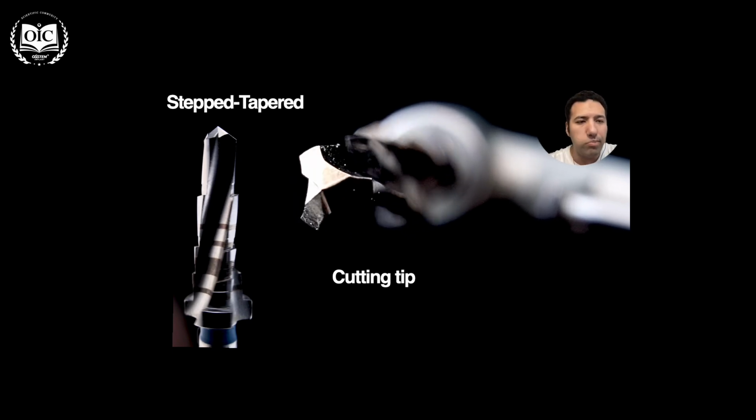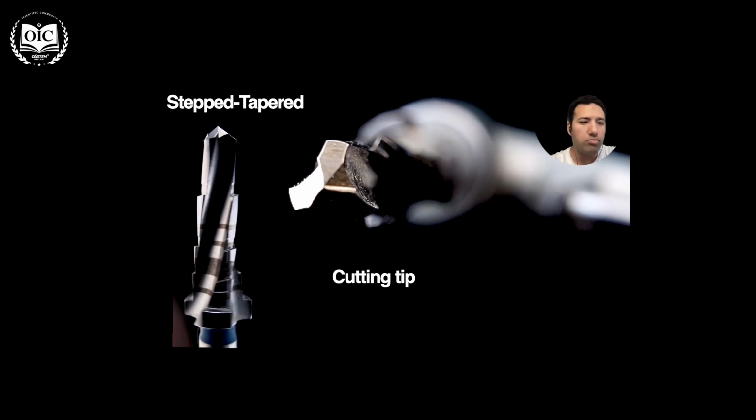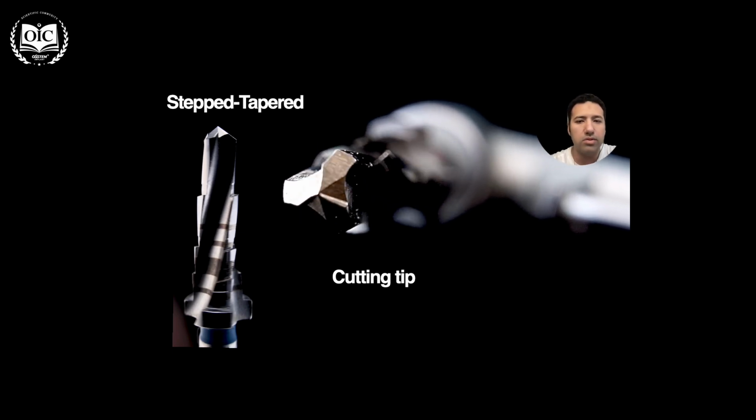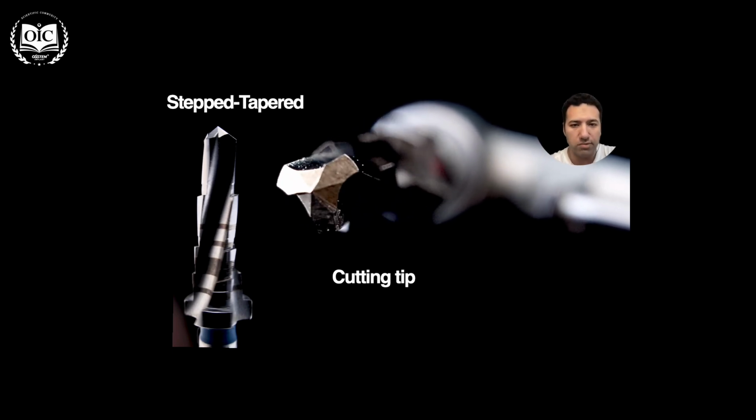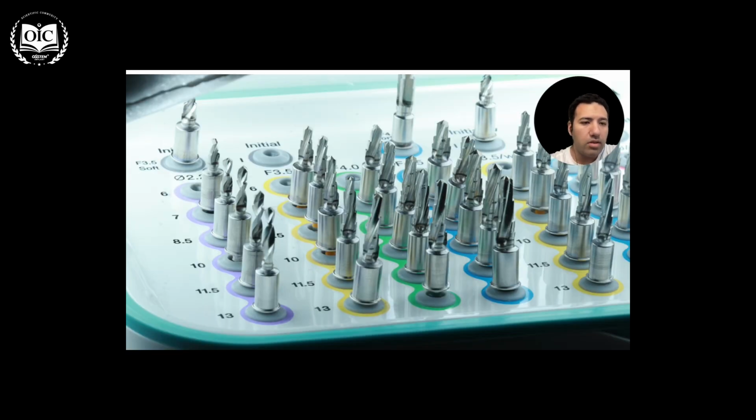And also the stepping, the design of the steps with the taper enables you to move laterally sometimes in the osteotomy to adjust the drilling position for the implant placement later on. They come in the regular lengths with Osstem 6, 7, 8.5, 10, 11.5, and 13 millimeter, with the extra 1 millimeter after the laser mark to enable you to place the implant subcrestally.